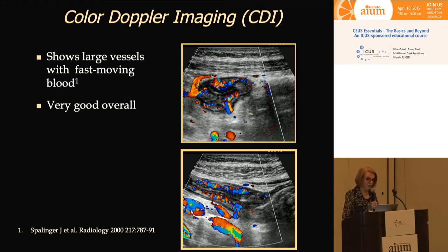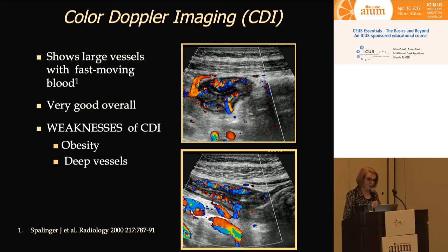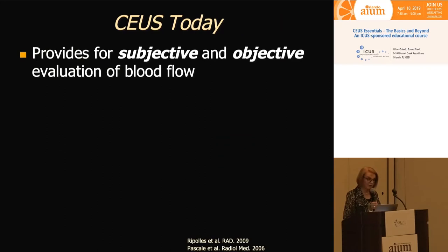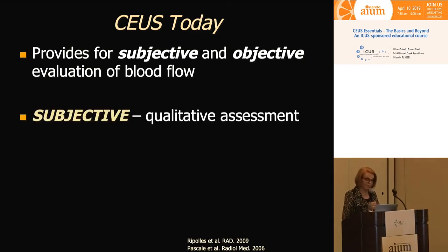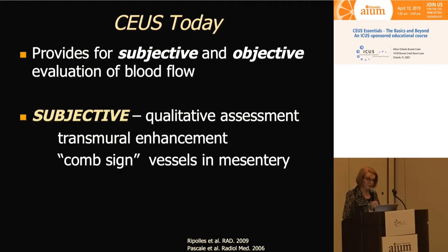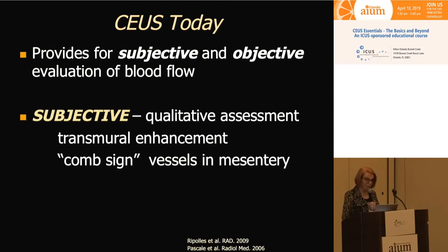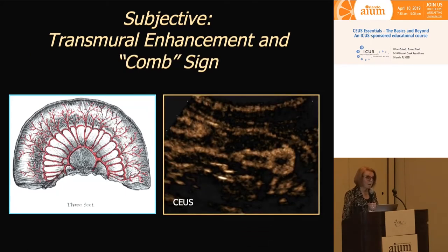With color Doppler on the picture, we can see beautifully the vascularization of the bowel wall. The problem with using Doppler alone is that if patients are very large or the bowel is very deep, we can't see blood flow well. Most importantly, we cannot ever see blood flow at the perfusion level. CEUS allows us to do subjective and objective evaluation of blood flow in the bowel wall. Subjective evaluation gives a qualitative assessment showing transmural enhancement or a comb sign in the mesentery and vessels.